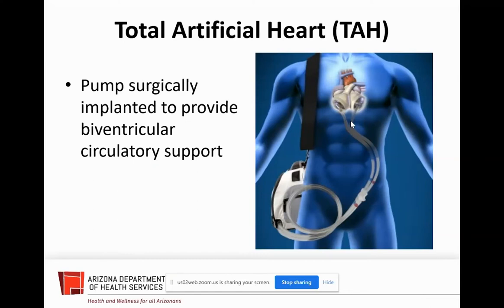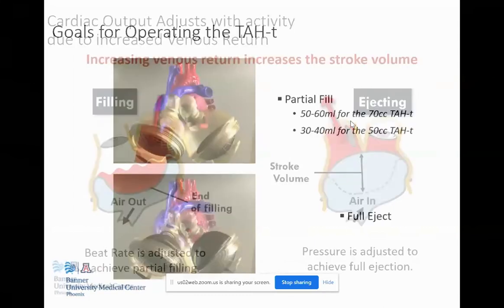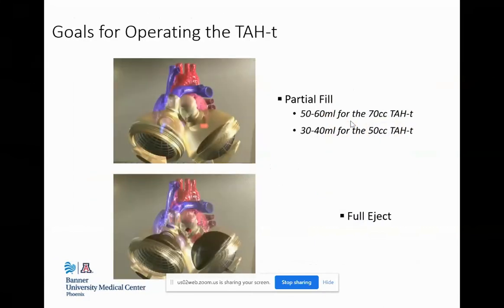What it does is it shoots air from the compressor up to the ventricles and completely ejects the ventricles, so it lifts the diaphragm up, pushing all the blood out, and then the air shuttles out of there, the diaphragm drops and fills with blood. Surgically, we cut both ventricles off, we cut all four valves out, and then we anastomose these plastic ventricles to the atria. So plastic ventricles, no tissue for their ventricles. The CCs that you might see on here are how much blood can fit in each bulb, or in each ventricle.